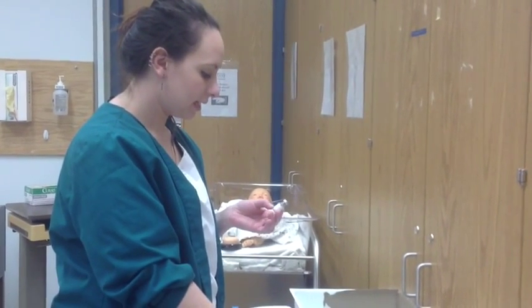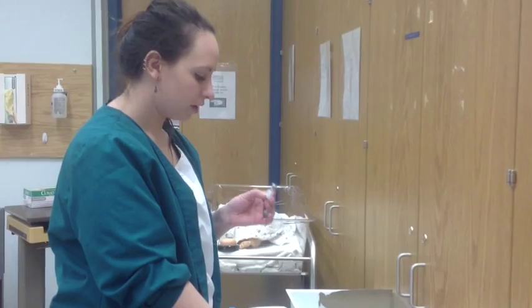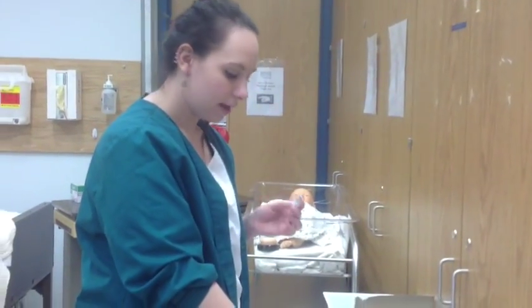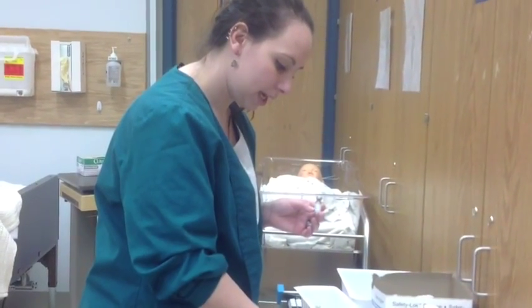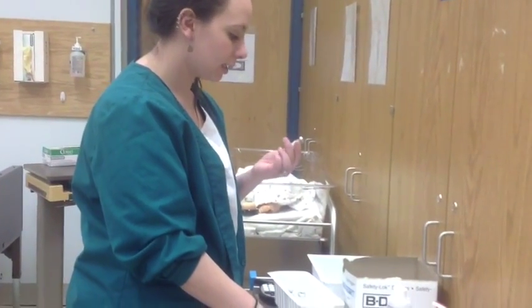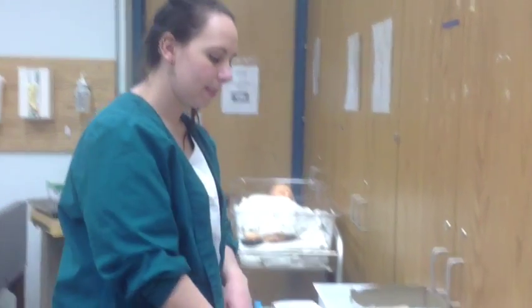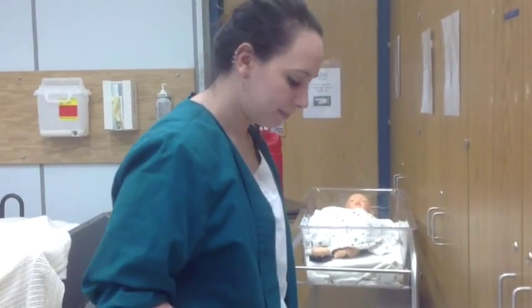This says that it has 0.5 mLs. So I have enough to draw up from this. And the expiration is intact. So you want to make sure you have the right expiration, otherwise you have to get a new vial. So with that being said, I'm going to take it out. I'm going to close my drawer.